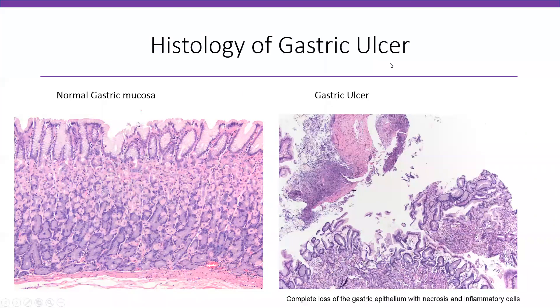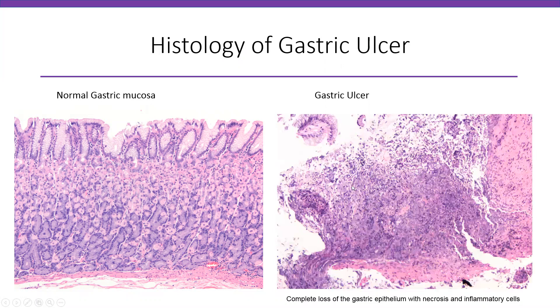For the histology of gastric ulcers: you can see multiple fragments of gastric mucosa with ulceration. There is a focal area of ulceration where the mucosa is completely gone. In the higher power picture, you can see the entire mucosa and epithelium are gone, replaced by necrosis and inflammatory cells.